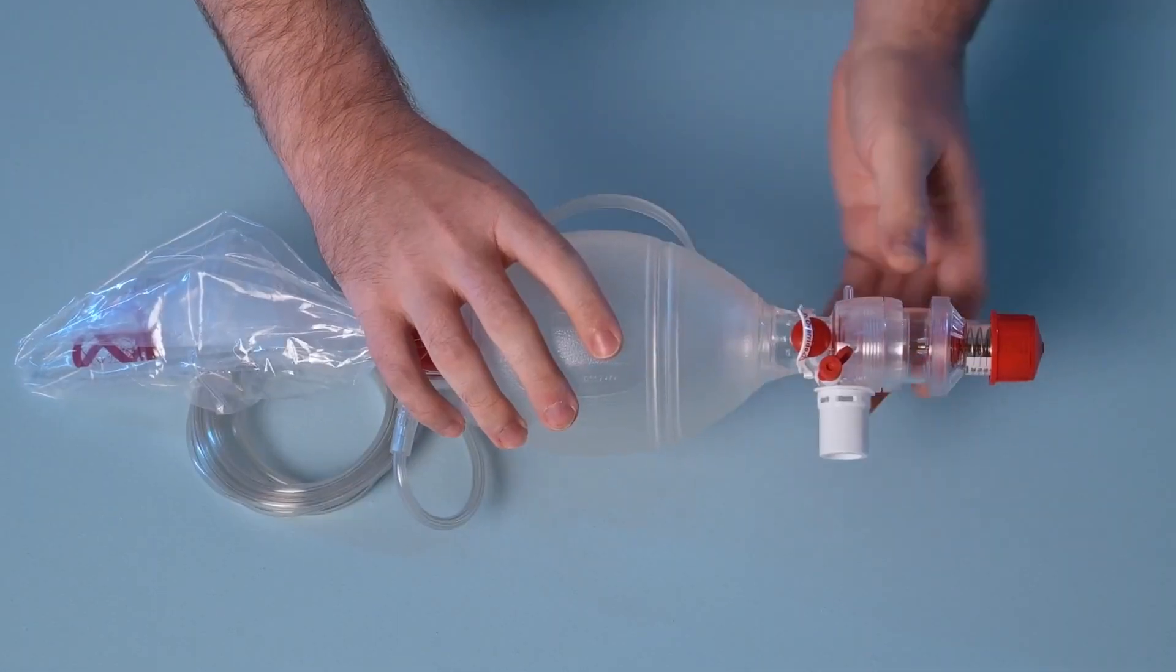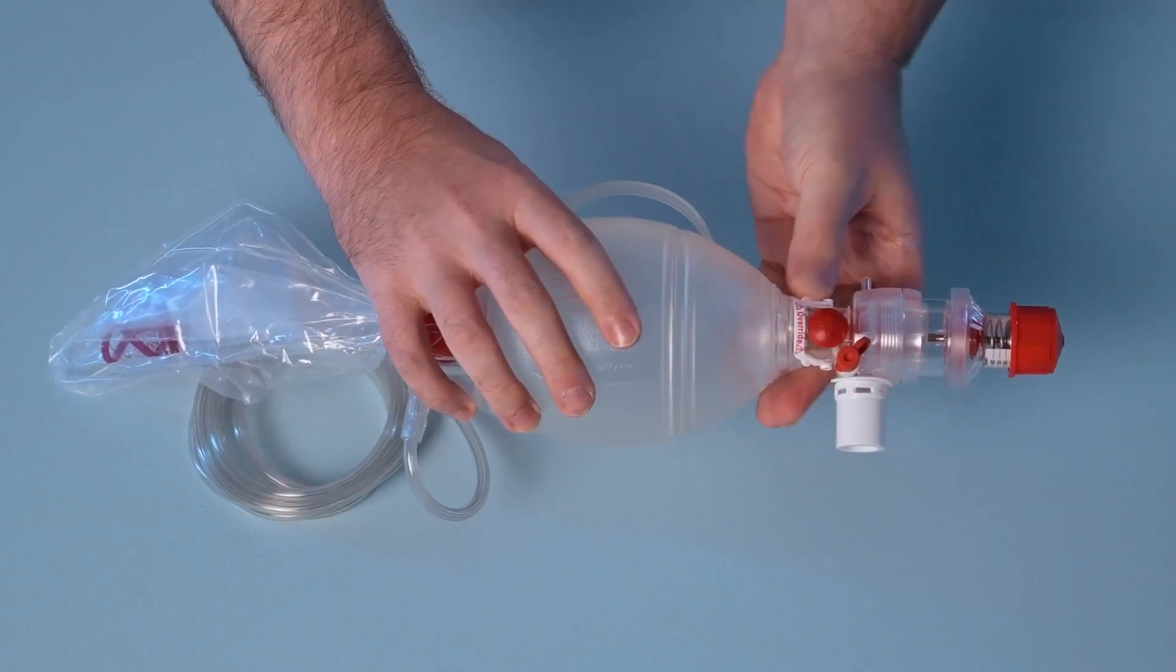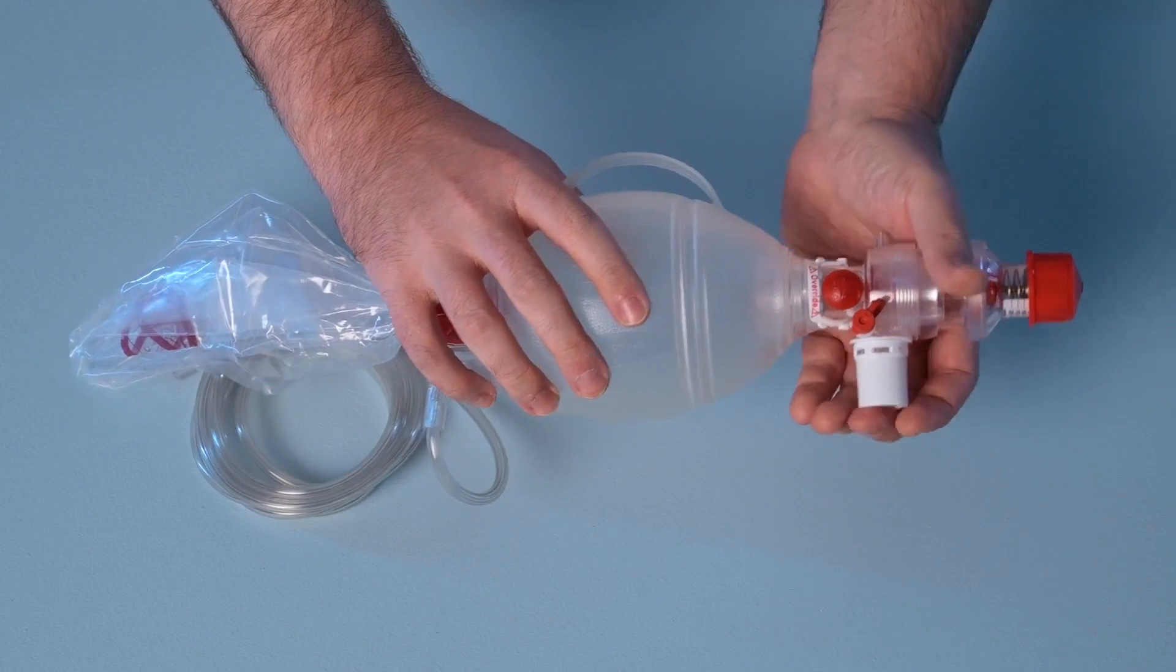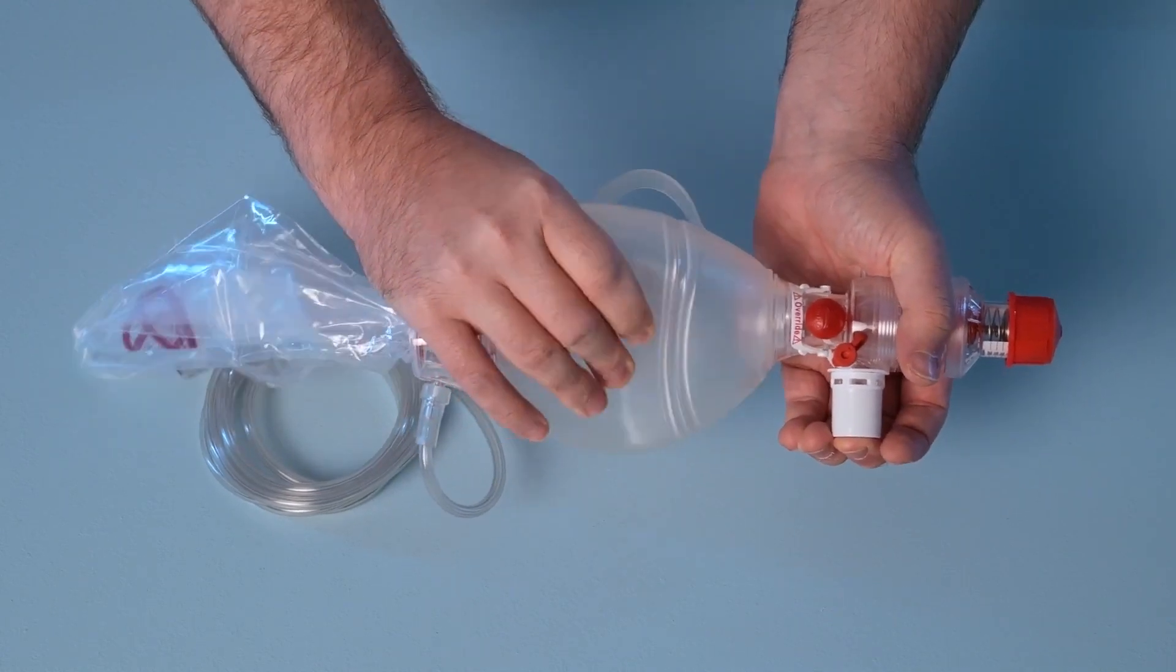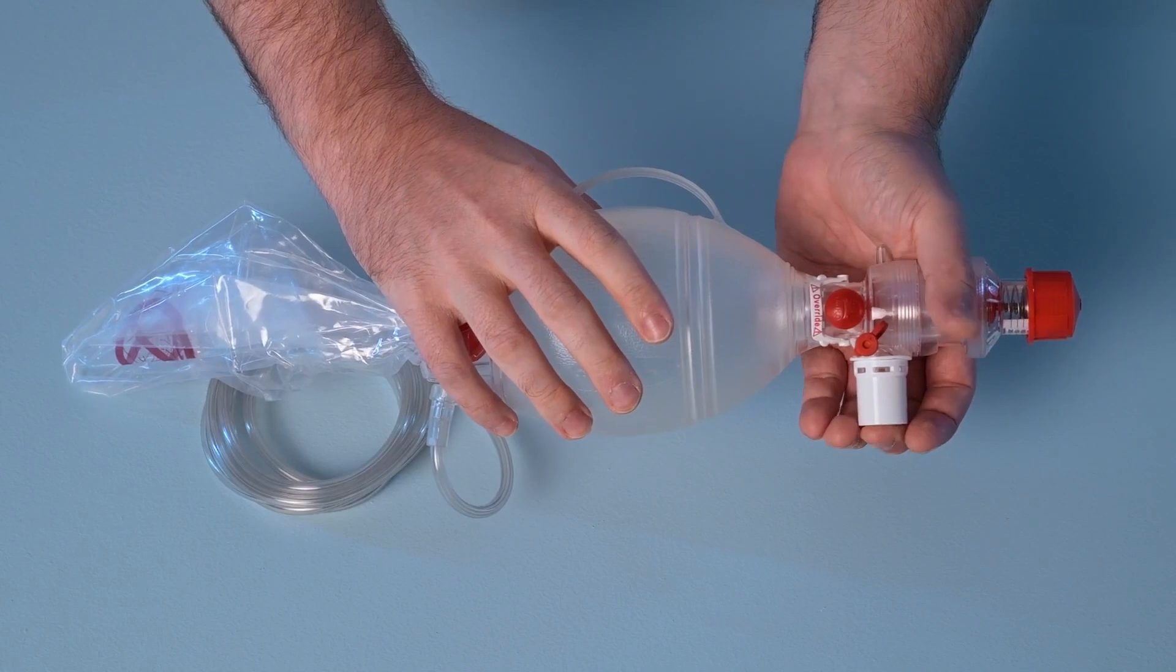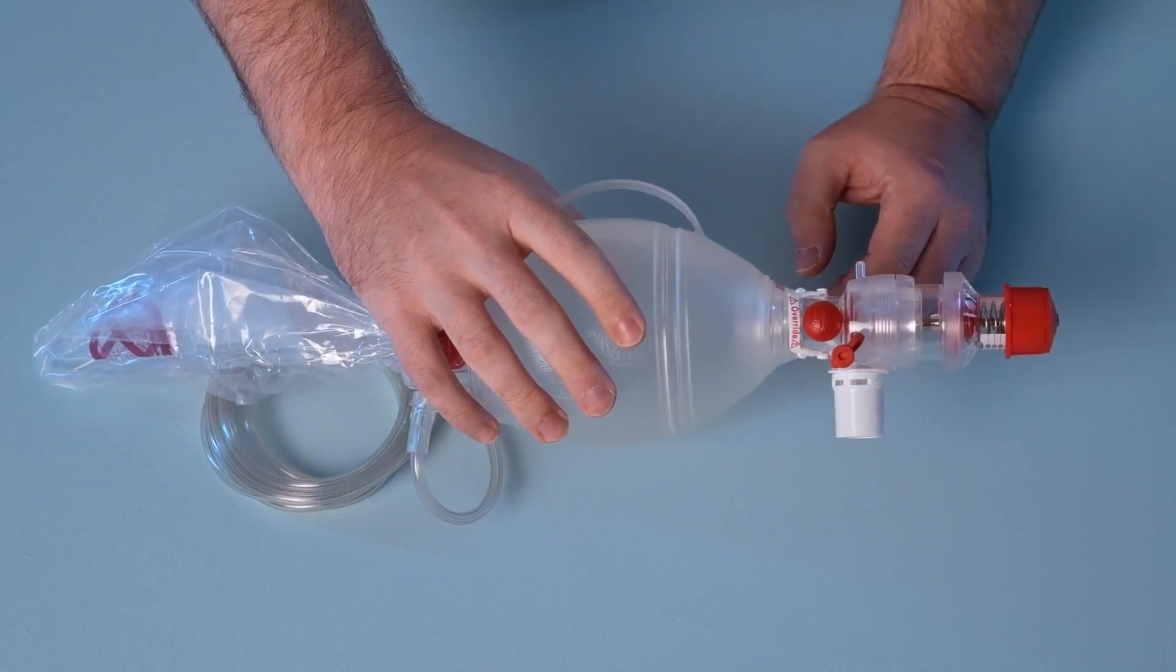Next, disengage the override clip and repeat the process. This time, the valve should activate, allowing for the air within the resuscitator to escape.